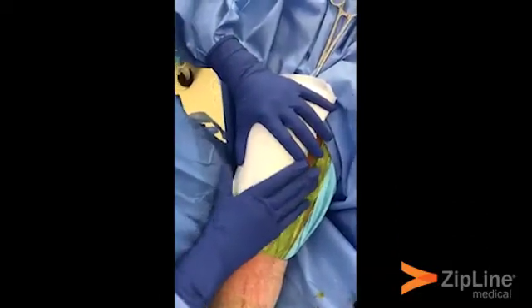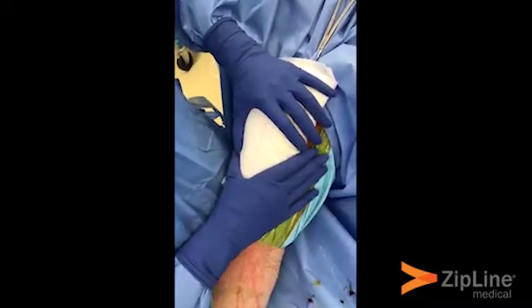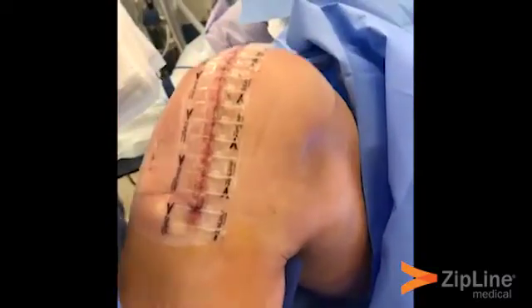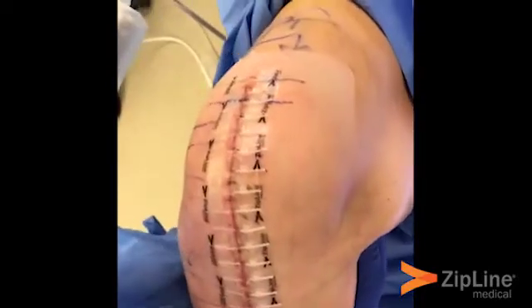In a minute we'll take all the drapes off. This patient had the contralateral left knee replaced six weeks ago, closed with a Zipline, and we'll show what the scar looks like at six weeks post-op. Here's the Zipline — you can see in max flexion the incision stays closed with no loosening whatsoever, and the Zipline stays in place.